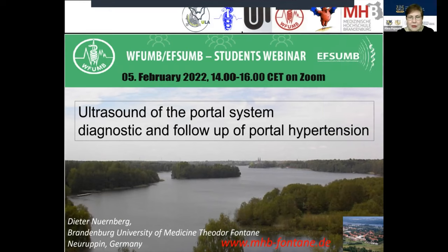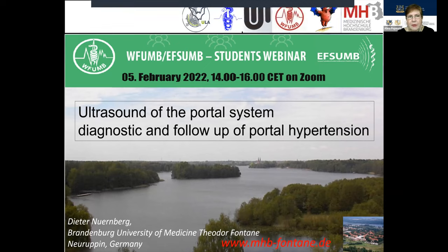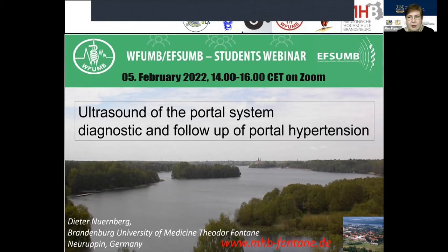No, I just wanted to say that it takes 5 minutes, or sometimes less than 5 minutes. The contrast study is usually around 2-3 minutes, so availability is extremely high compared to cross-sectional imaging, where it's more difficult to have the study. You need the program, and the contrast has to go through the kidney, so it's more complicated. This is why we use it a lot in practice.